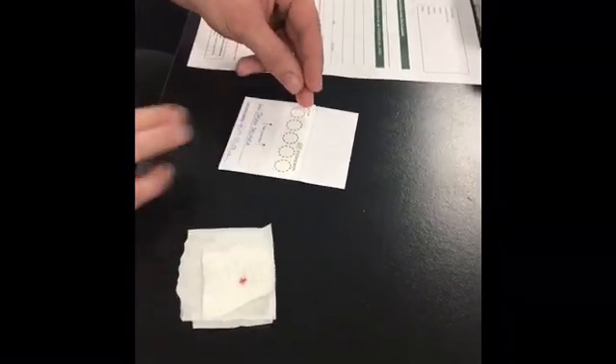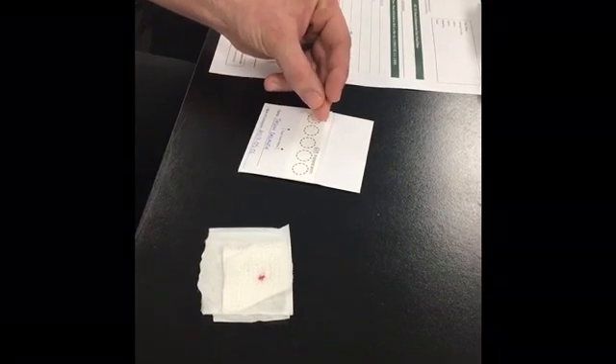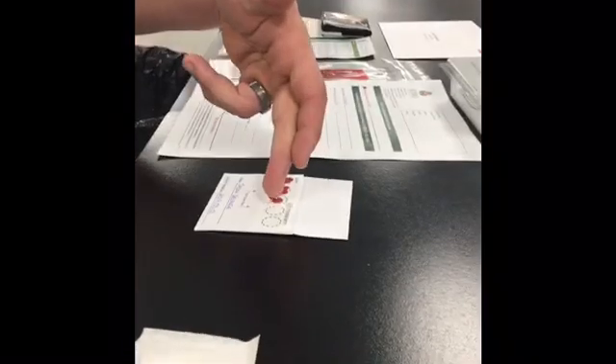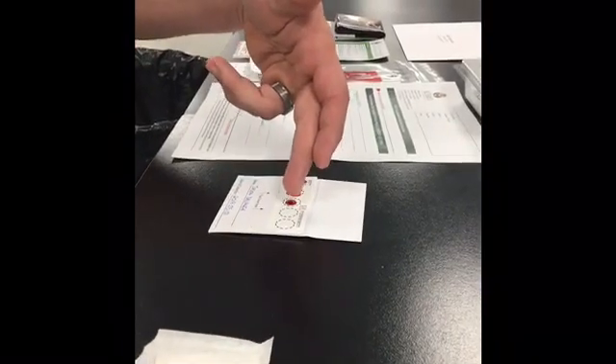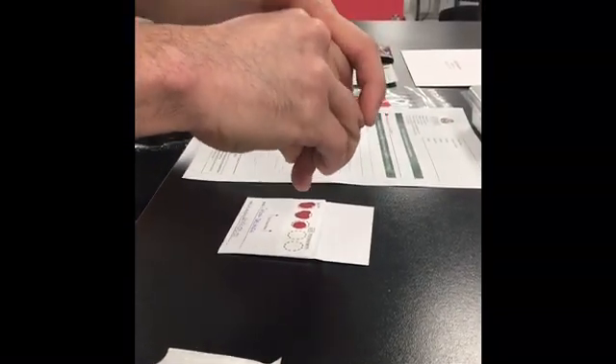Wipe away the first drop of blood with the gauze. Gently massage the finger to produce a large droplet of blood. Apply the droplet to one circle of the blood spot card. Continue to wipe away the blood from the puncture site if needed, massaging the finger until the remaining circles are filled.